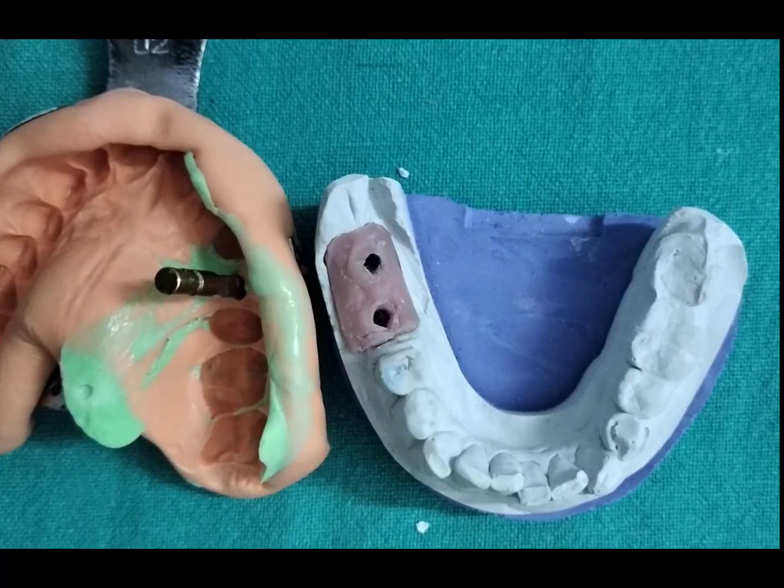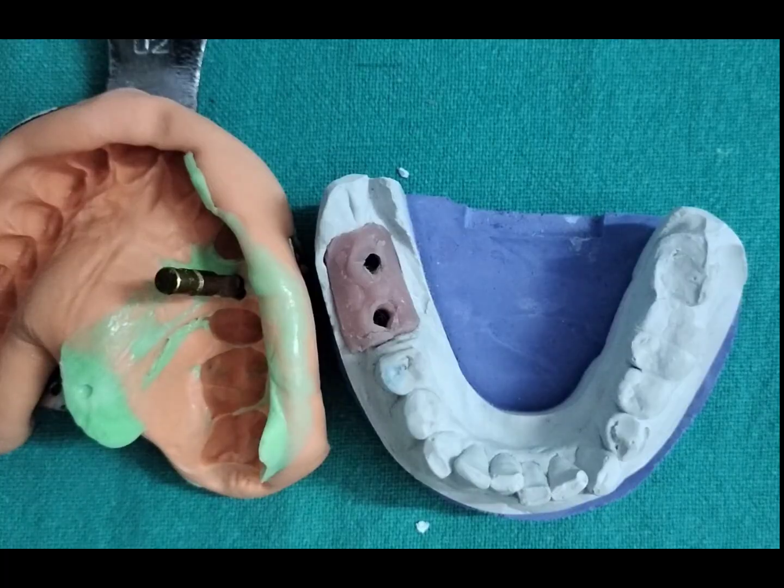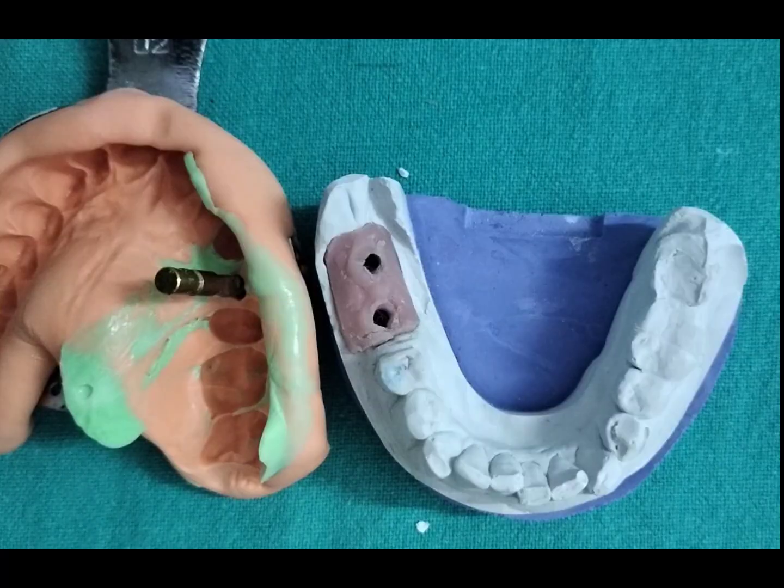So what are the advantages of closed tray technique? Advantages of closed tray technique are it's a simple procedure, it is comfortable for the patient, easier in the posterior region, and it requires less chairside time. Drawback is it is less accurate when you are making an impression for multiple implants, and also when we are repositioning the impression coping onto the impression, the chances of error are there.